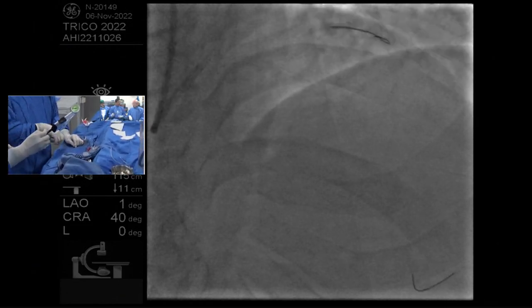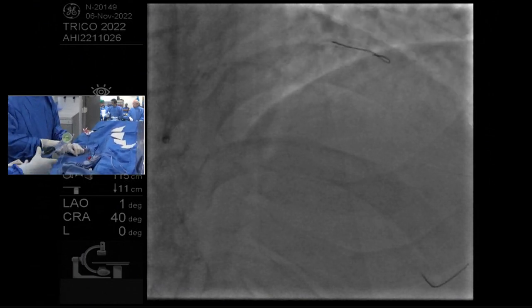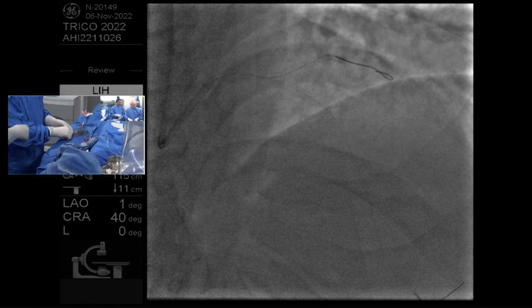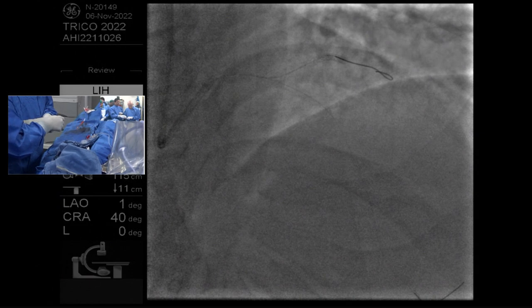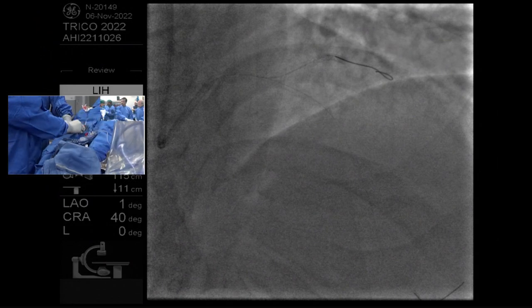A question on imaging, Sanjay. With that tiny lesion like that, and the OCT... OCT is also ready. Whether it's IVUS or OCT, you'd have to open the lesion before you could image that, because you're barely able to get a balloon across, right? Yeah, the IVUS catheter, nothing's going to go. But there's nothing wrong with opening the lesion prior, right? That's usually my algorithm.